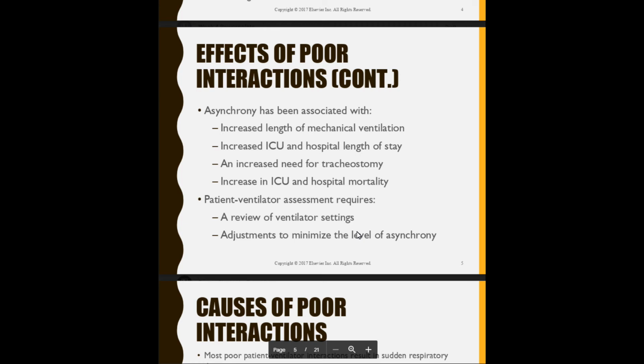Or if they're pulling volumes, let's say in their own triggered breath, they pull 420, but on AC you program 550, they're going to get that 550. So right there, that's going to cause possible overdistension, because if they're pulling 420 and that's what they are normally pulling, and you're giving them 550, that might cause some overdistension. That's going to cause some asynchrony there.